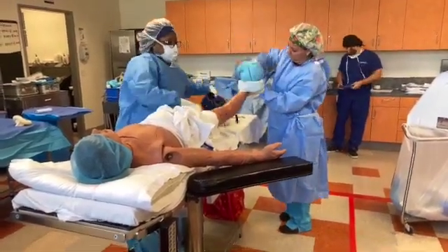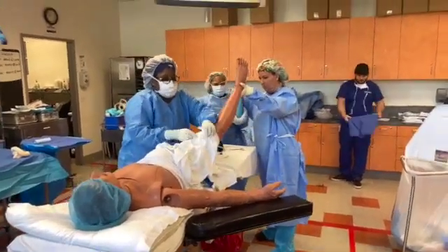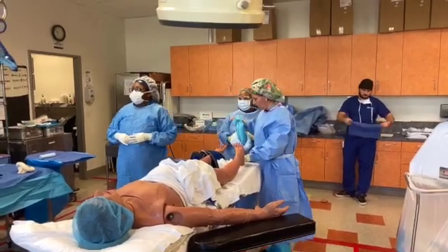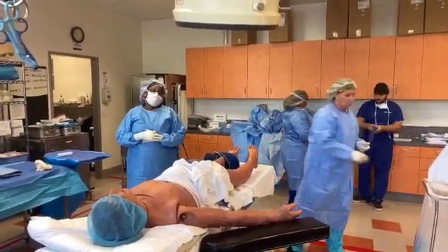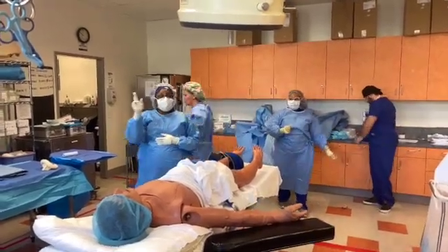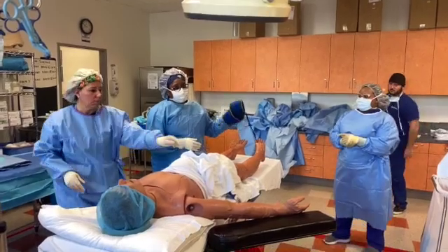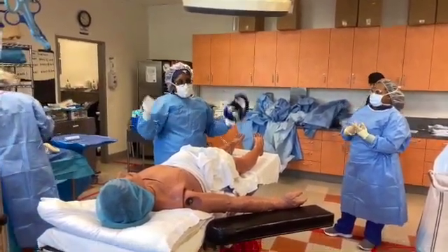And when we say ortho is like this at the end, they are not joking. At this point, dressings come on and everything like that. And the last thing is to document the time tourniquet removed. You have tourniquet up, tourniquet down, total tourniquet time. What time do we get this off? Okay. You rarely will see that one, but it's there, so just make sure you have it.